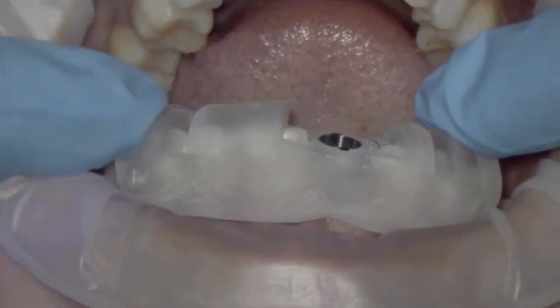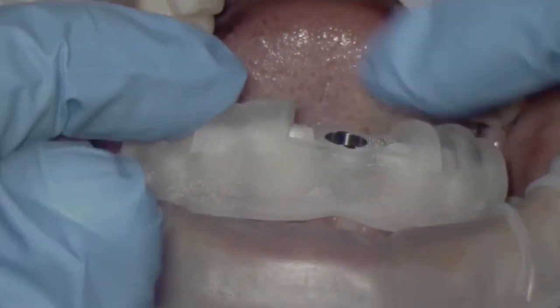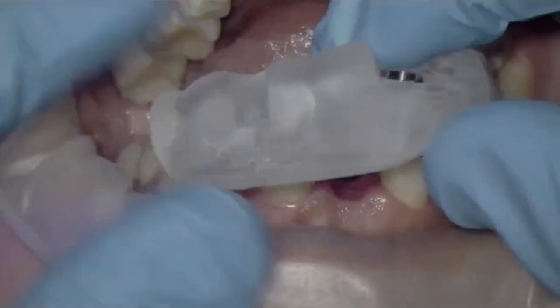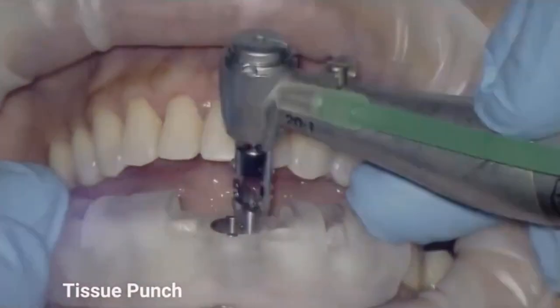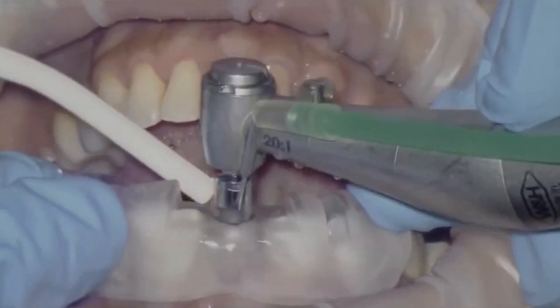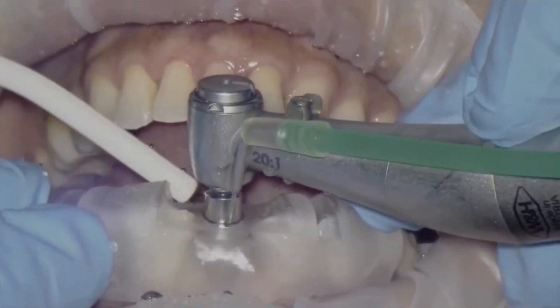Again, this is the power of 3D printing. Not only can you print single crowns or bridges, you can do so many things with it. It's perfectly fine. Next thing, we're going to do a tissue punch. Now, we designed this.